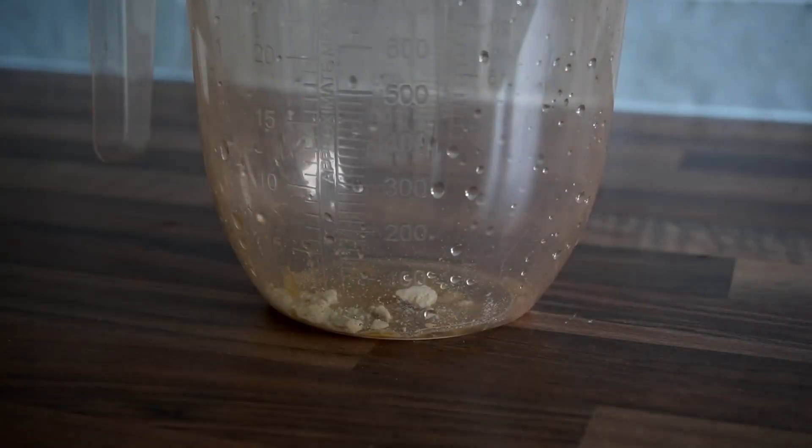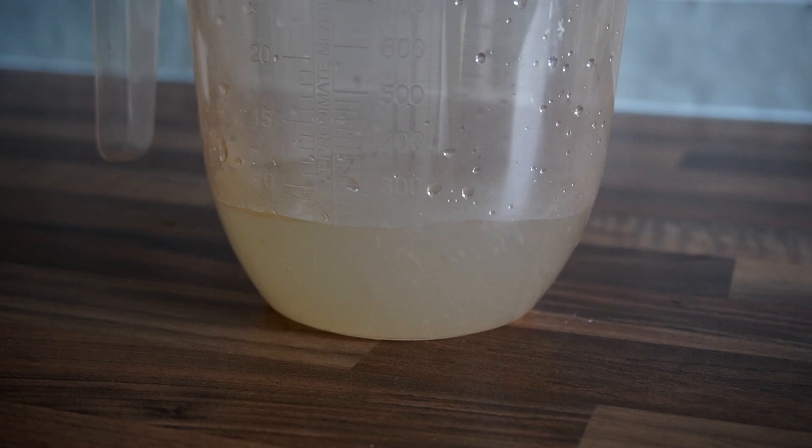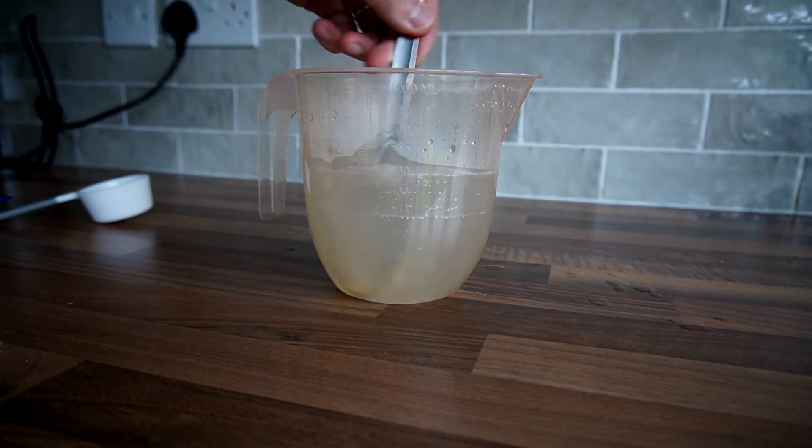Next, add 600 milliliters of water to the measuring jug, and then mix it with a spoon until you can't see any of the light malt extract.